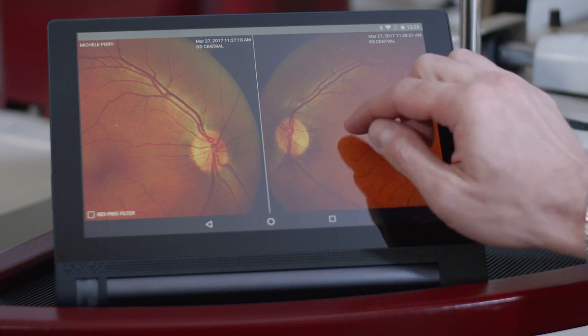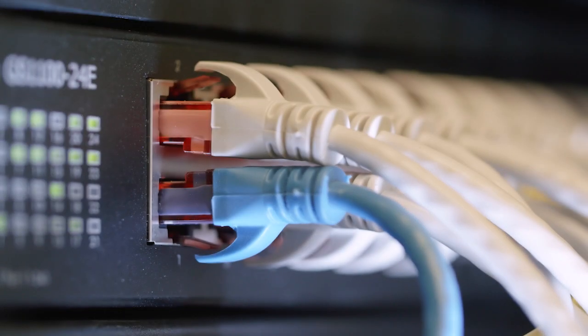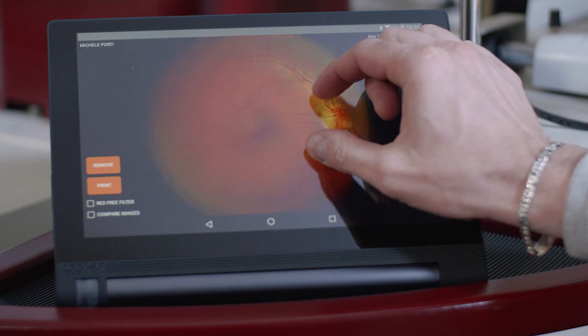The secure encryption infrastructure means it is possible to back up images by saving them to the cloud. Alternatively, they can be saved locally to the examination site's own database.